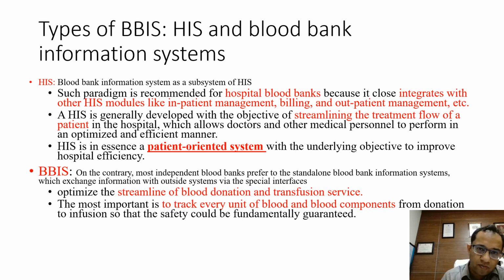Now, the blood bank information system can be of two types. It can be a hospital information system-based interface, or a blood bank information system-based interface by itself. So what is an HIS and what is a BBIS? When you have an HIS-based system, the blood bank information system is a subset of the HIS. This is usually recommended for a hospital blood bank because it closely integrates with the other HIS modules, the hospital interface modules, like inpatient management, the billing, the OPD, and all those things. So in all of that, you will have a subsection for the blood bank.